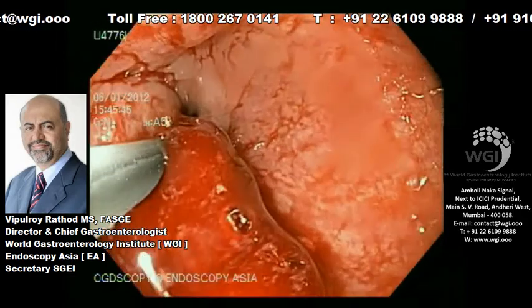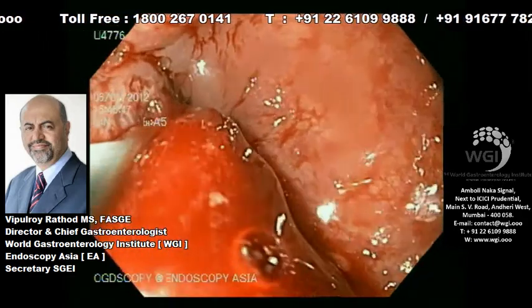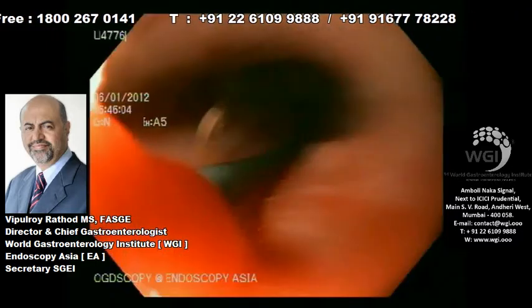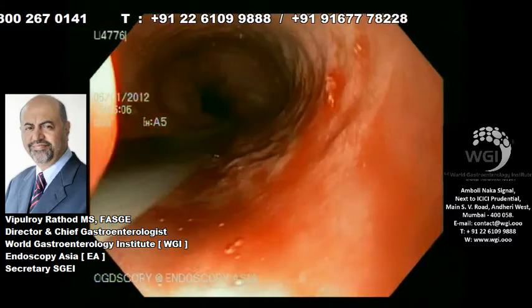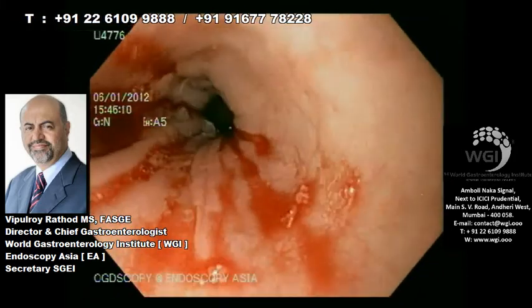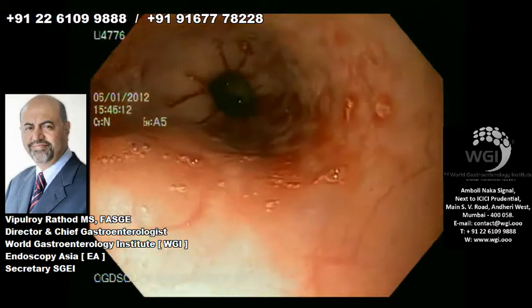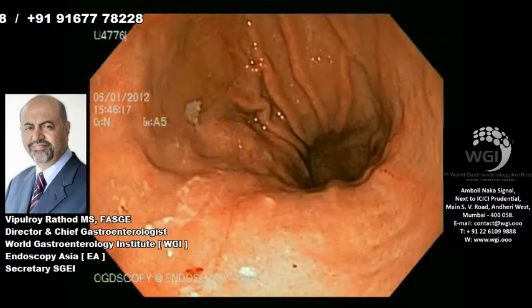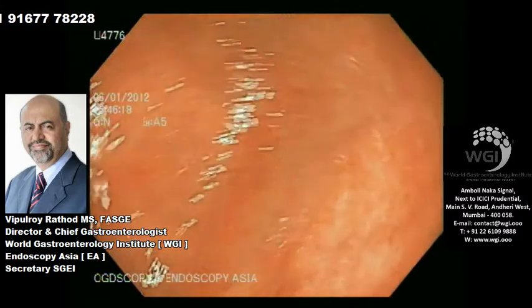There are some schools which do not believe in this, but we always make sure that we load a dilator over the guide wire and over the dilator we thread the scope — railroad it across the stricture, as you can see here. We've gone across the stricture in the upper third of the esophagus and now we will gently move on into the stomach.